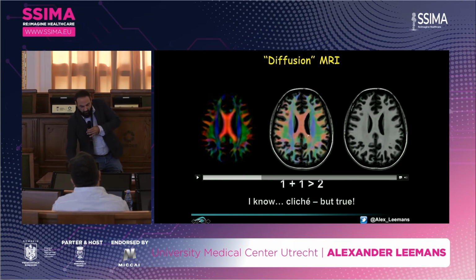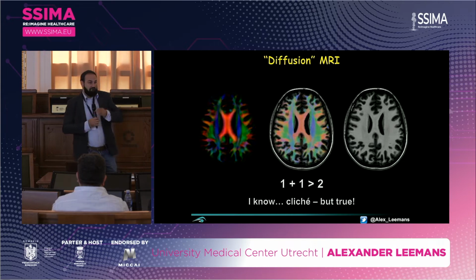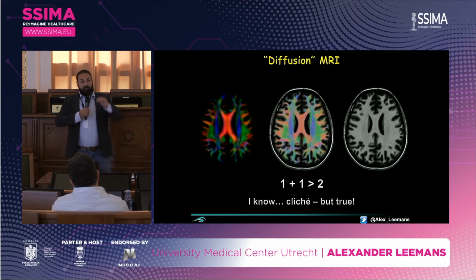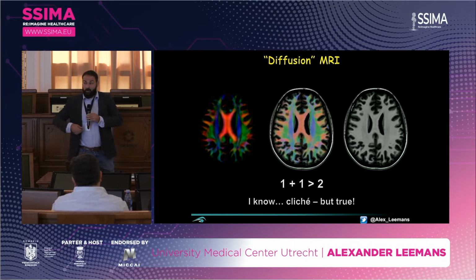And if you, again, focus on this middle part here, you can clearly see pathways going up, down, which is 0, 0, 1, up, down, which is blue. So blue is pathways going up, down. So these are probably the motor pathways, corticospinal pathways. In green, front, back. These are association pathways. And then in red, you can see pathways going left, right. This could be, for instance, lateral projections of the corpus callosum. So we become a lot more specific.